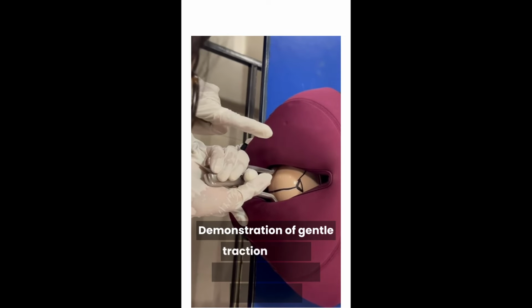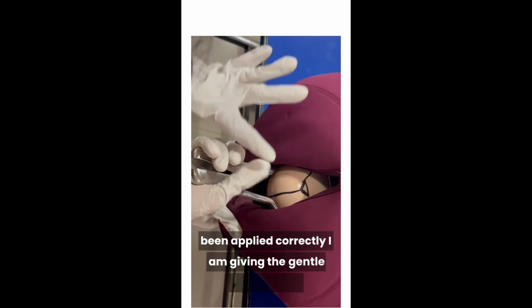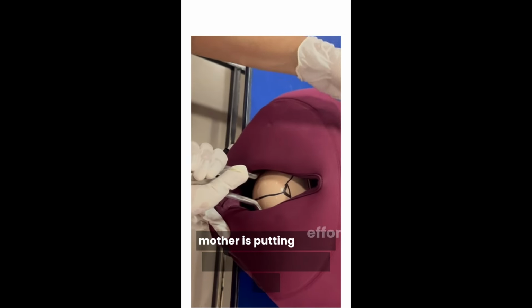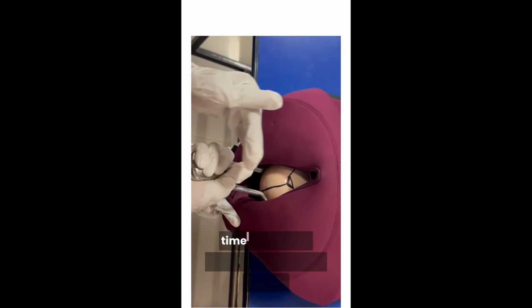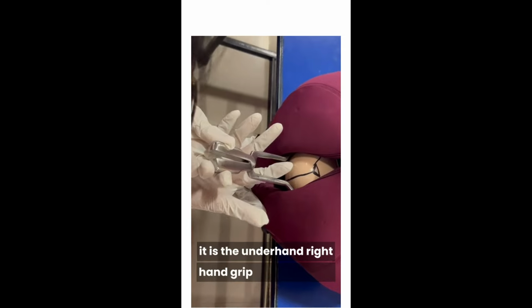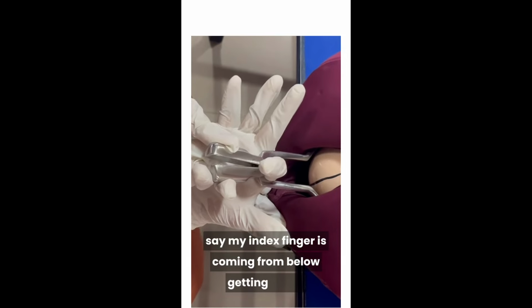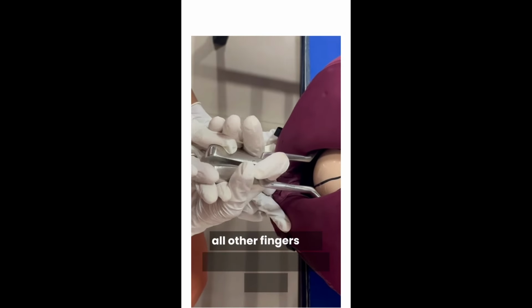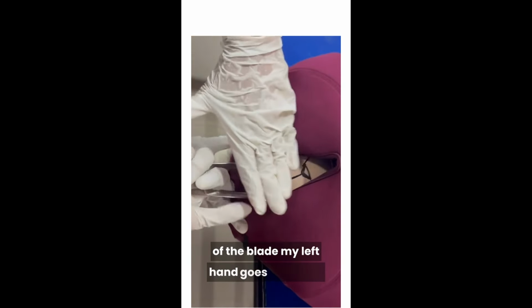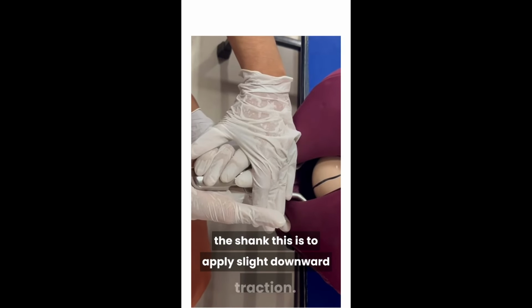Demonstration of gentle traction. Having confirmed that the blades have been applied correctly, I am giving the gentle traction only when the mother is experiencing pain, and also when the mother is putting efforts of bearing down. Only at that time I am giving traction. The way I am holding it is the underhand right hand grip. That means to say my index finger is coming from below, getting inside. All other fingers are being used to hold the handle of the blade. My left hand goes in front of the shank. This is to apply slight downward traction.